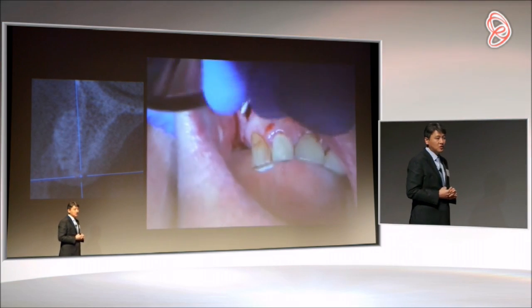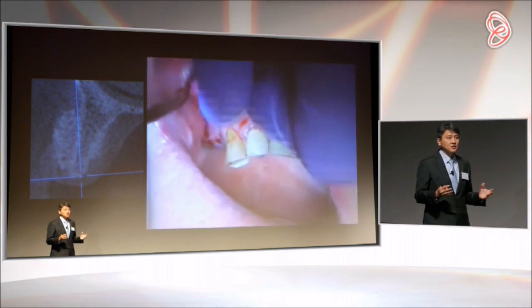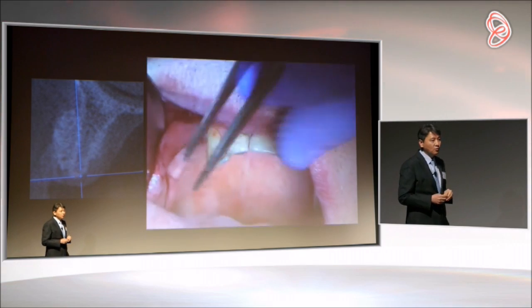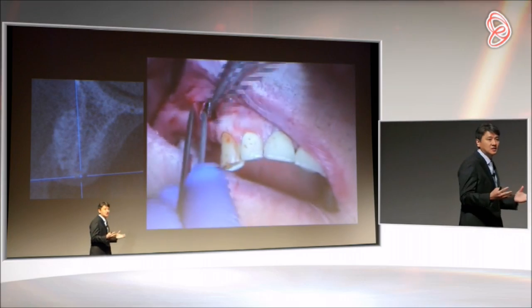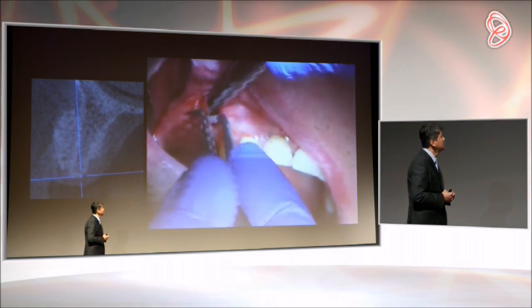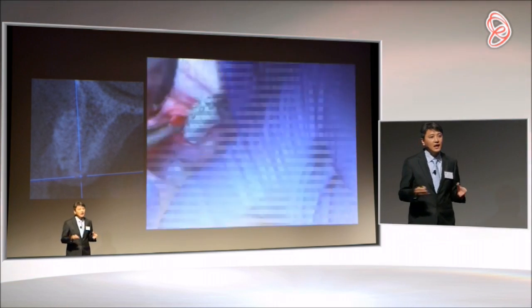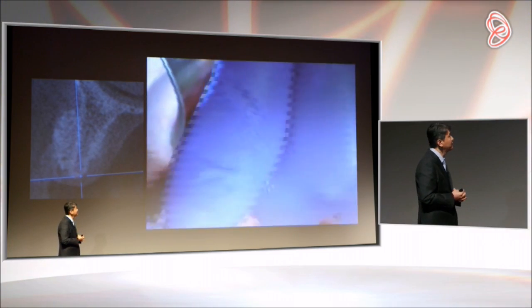And we will introduce collagen membrane. We like to use pericardium. And the secret here is you must use this pericardium when it's dry. Once it's wet and it loses its rigidity, then it will be very difficult to do this technique. So we will open the collagen membrane inside the tunnel, and we will inject freeze-dry bone into this tunnel.